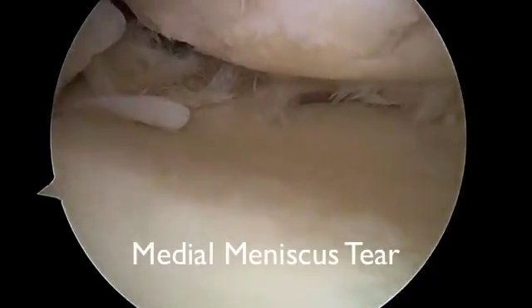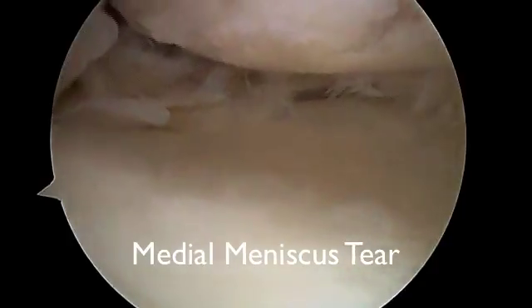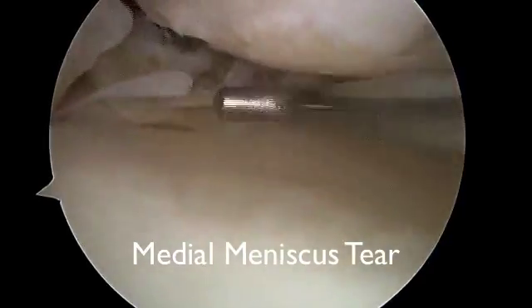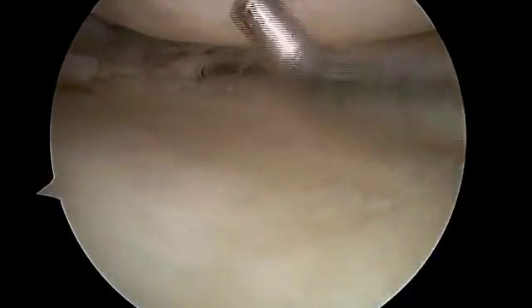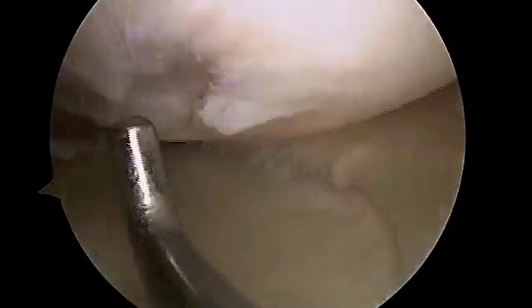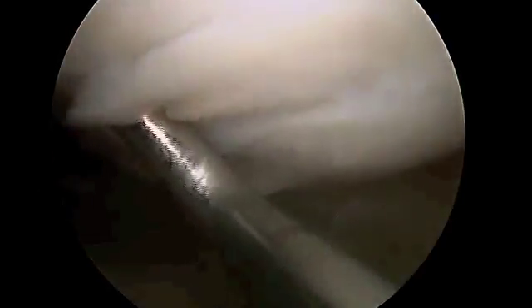This is looking inside of a knee of a gentleman who was having persistent recurrent swelling and pain, using a metal probe almost like a finger to give you a tour of the inside of the knee. You can see this is articular cartilage damage — this is unstable articular cartilage damage.